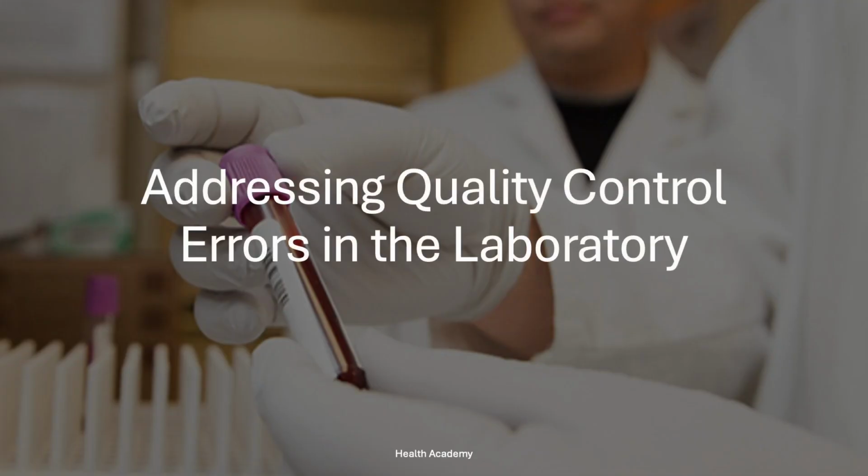Addressing quality control errors in the laboratory. Quality control errors in laboratories are categorized into random and systematic errors. Random errors are unpredictable fluctuations affecting test precision, while systematic errors are consistent biases that skew results. Addressing these errors is crucial for accurate laboratory testing.